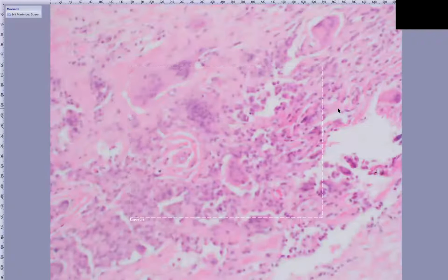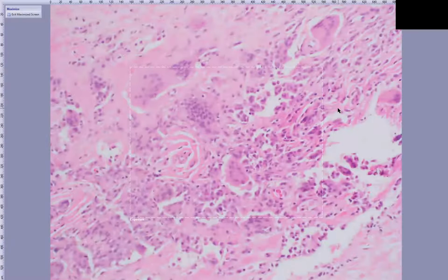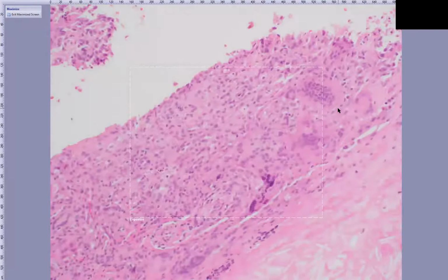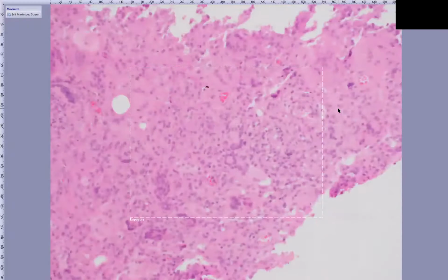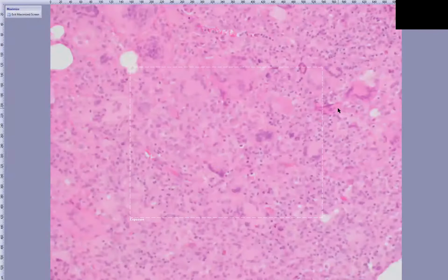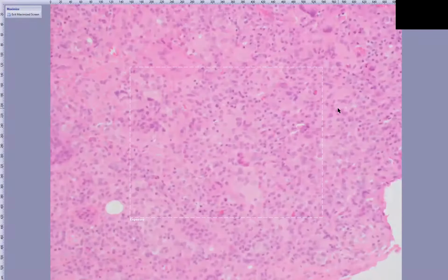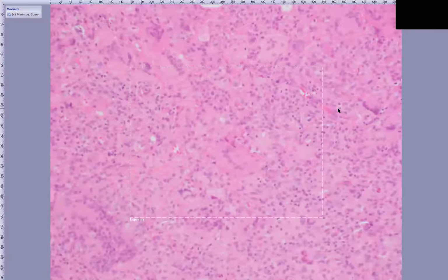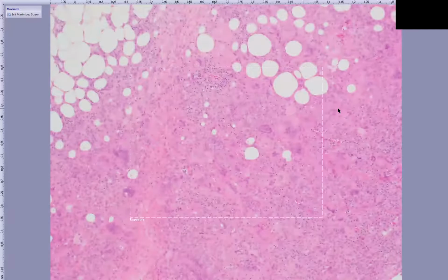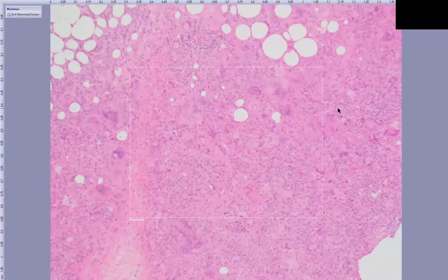And this is a zone that's showing mostly epithelioid histiocytes with admixed giant cells. So this is not a terribly inflamed lesion, but if you do have inflammation, you will see plasma cells, lymphocytes, eosinophils, and it'll be a heavier infiltrate relative to what you might appreciate in xanthogranuloma. And those are the key features that allow you to distinguish xanthogranuloma from necrobiotic xanthogranuloma. Okay.